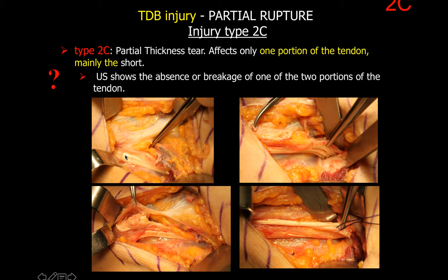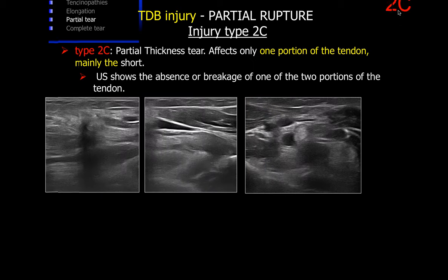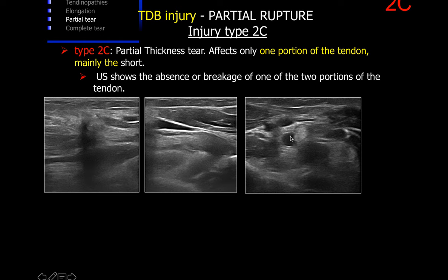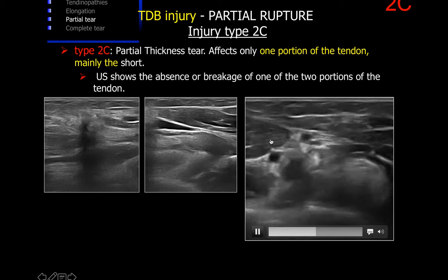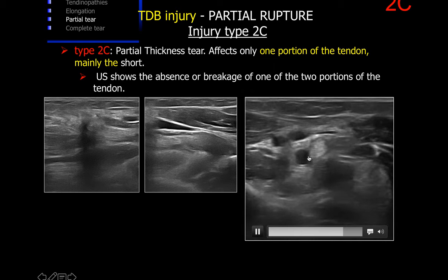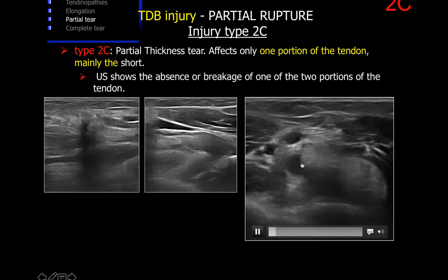Due to an isolated complete tear of only the short head, while the long head still remains in continuity onto its insertion, we have classified this type of complete retracted tears affecting only one component of the tendon as Type 2c lesions. In Type 2c, with a complete tear of only the short head, we see the stump, and one component of the tendon really disappears. The damaged tendon component appears retracted and irregular, and we find the retraction of the broken component and the absence of part of the tendon in the short axis.